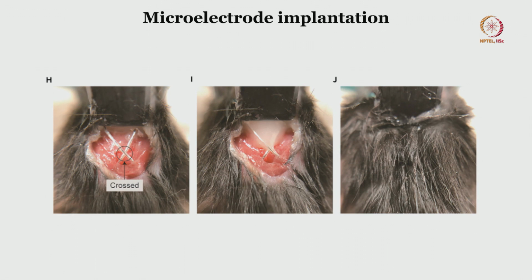So, once that is done, then comes the anchoring part, where you need to hold the implant in place and cover the area with the skin, alright. What you are seeing here is basically the bottom of the implant, and these are the skin edges that are brought close to the midline.